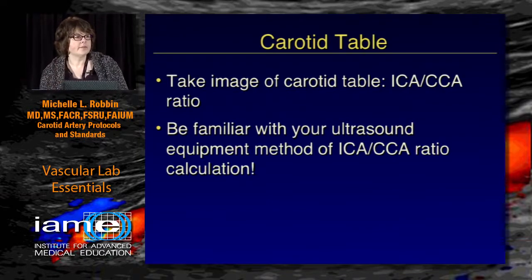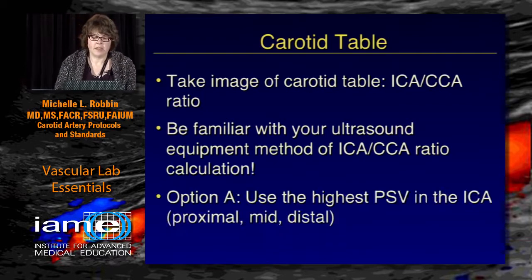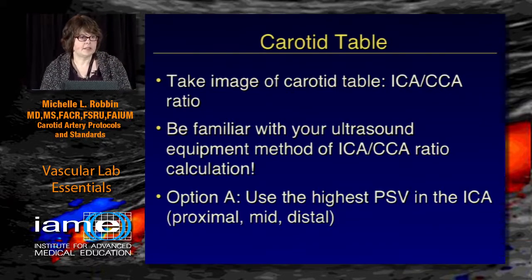But you need to be familiar with what your particular ultrasound equipment uses and how it calculates its ICA-CCA ratio. Do you all know how it calculates it? I see at least one person that knows that. This is really very important.